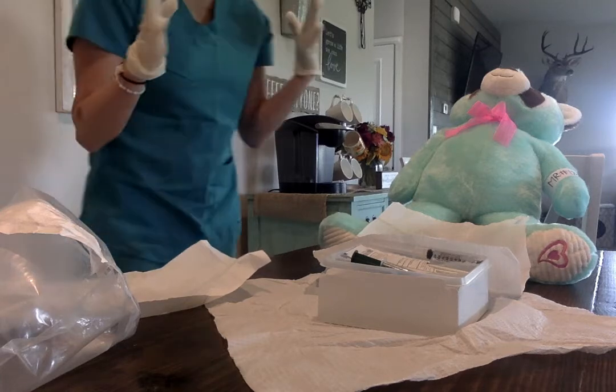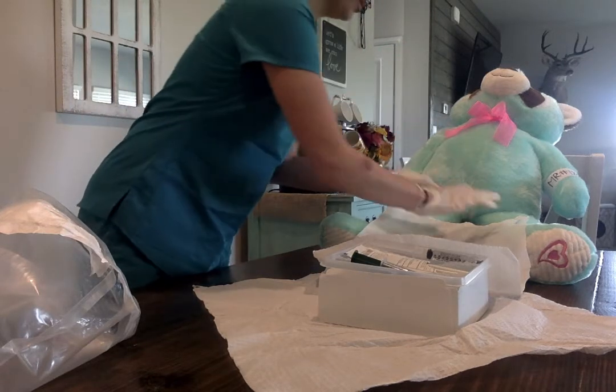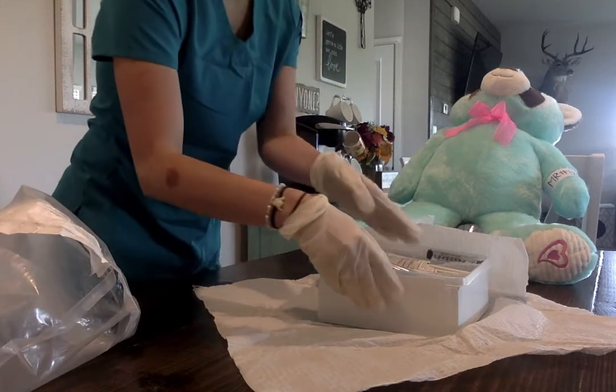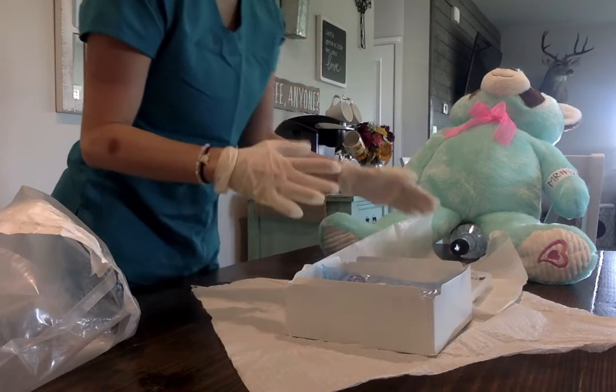Okay, now get this out of the way. Okay, now that I have sterile gloves on, I'm going to push this drape down and just create a better working area for me. Okay.